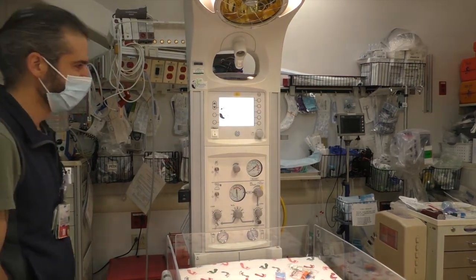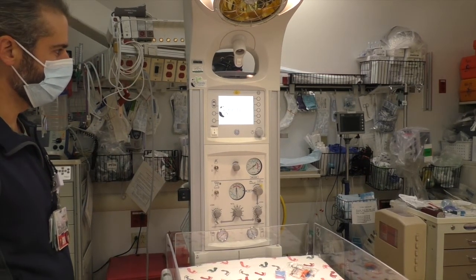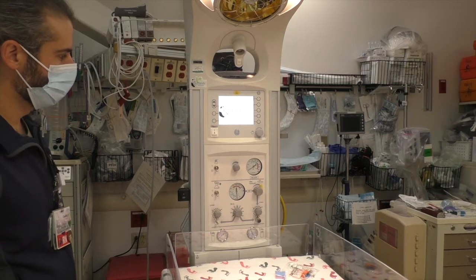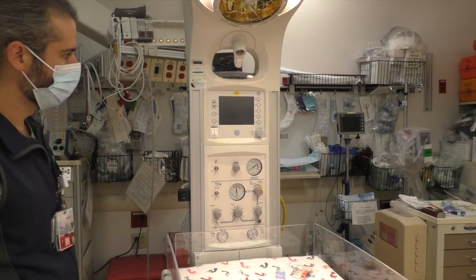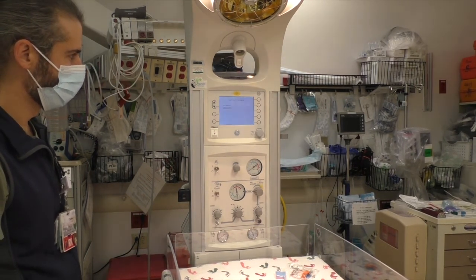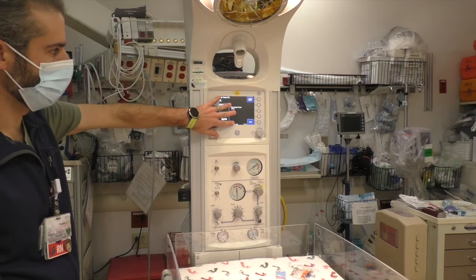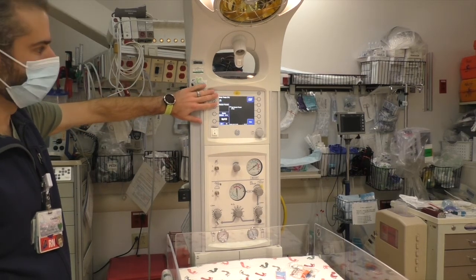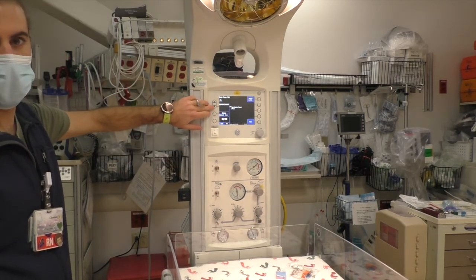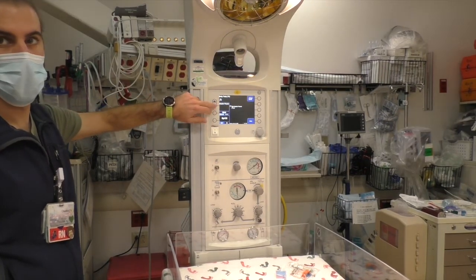It was already on, sorry guys. So as it's turning on and powering up, the first thing that you'll need to do is admit the baby, and this will go through after the cycle starts. It'll hit admit baby, and then this will be able to show you all of the monitor, and you can control their temperature, have a pulse ox that's attached to them that'll display right here, and determine whether or not you want to do manual heating or go on baby mode, which you can set the temperature that you want them to be at right on it.